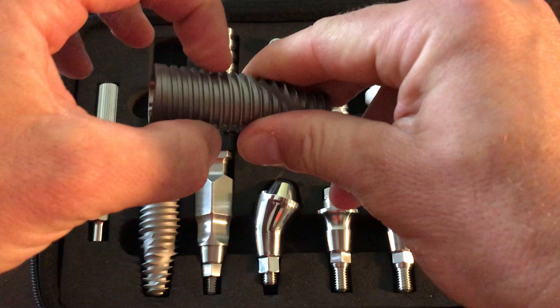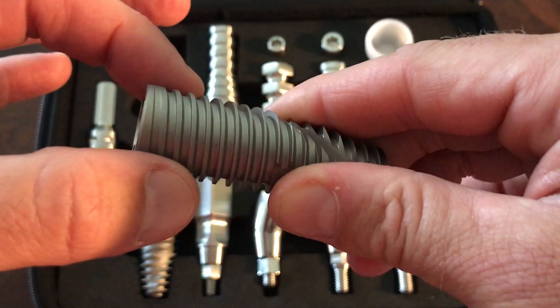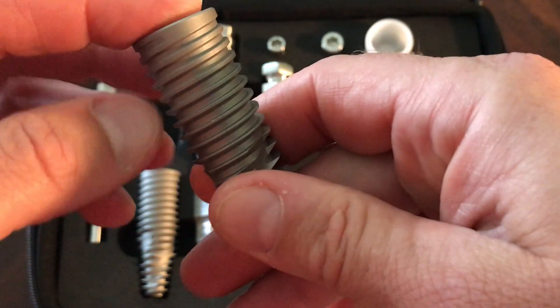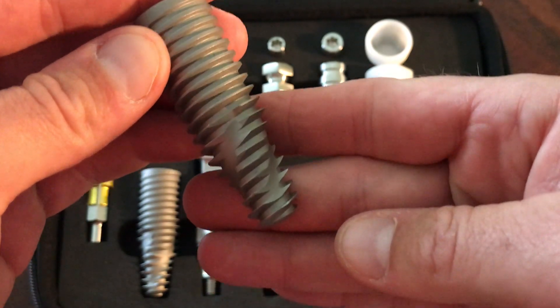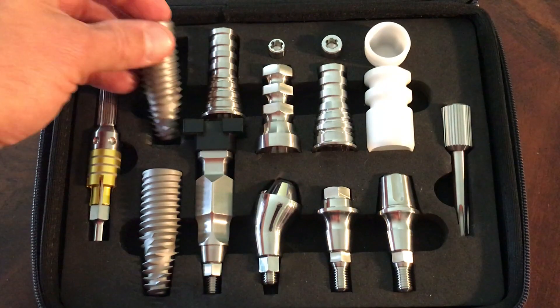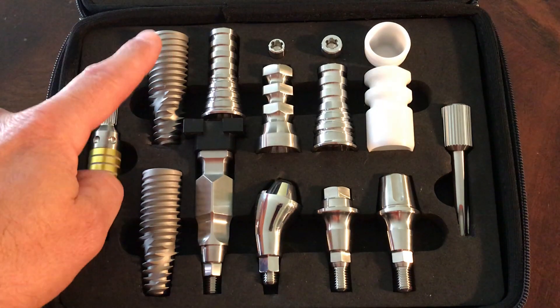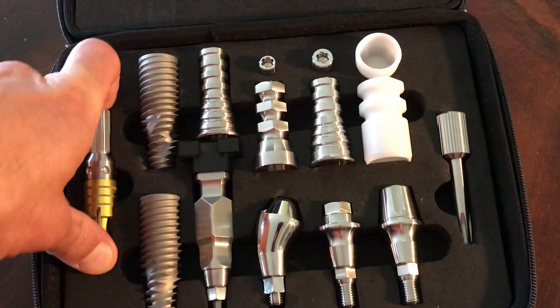As you get towards the second half of the implant, the upper portion, the threads are more squared off for secondary compression into bone, so it's a fantastic implant. A nice thing about the system is it can be used in all types of bone. We have what's called a plus-one drill — it's a slightly wider drill added to the surgical kit so that we can place this in even dense bone.